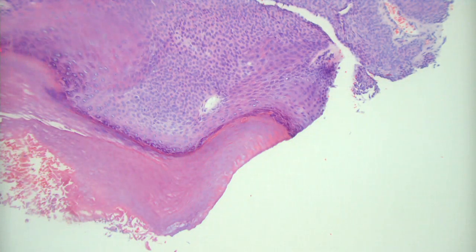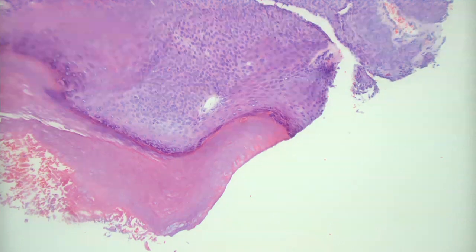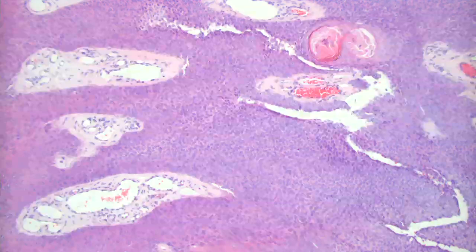It might be a blood vessel. It's probably a duct over there. But it's kind of a diffuse proliferation of these very monomorphous little basophilic cells. So what's the most likely diagnosis? Poroma. Yeah, eccrine poroma. It's a nice example of that. It's a beautiful example of that.